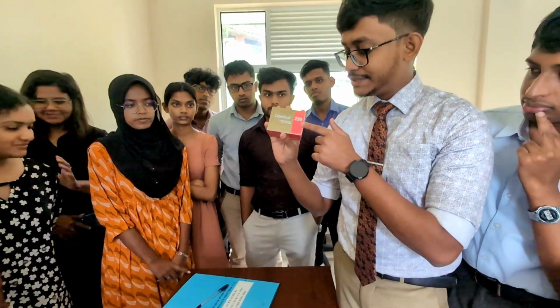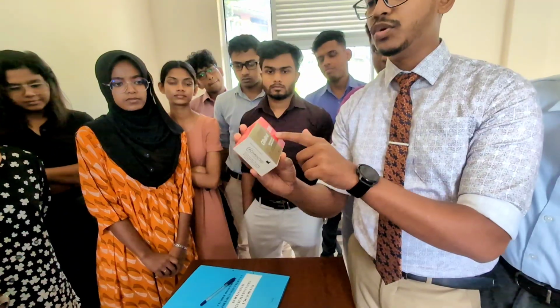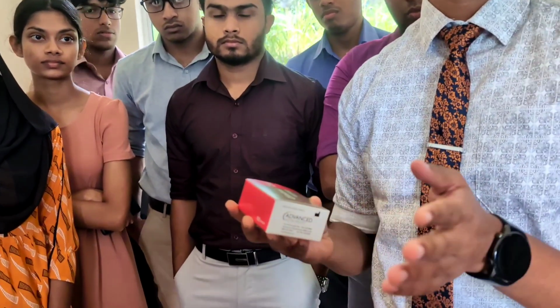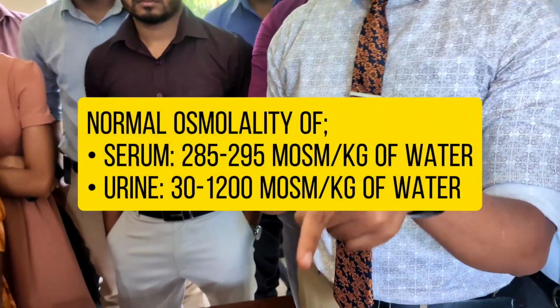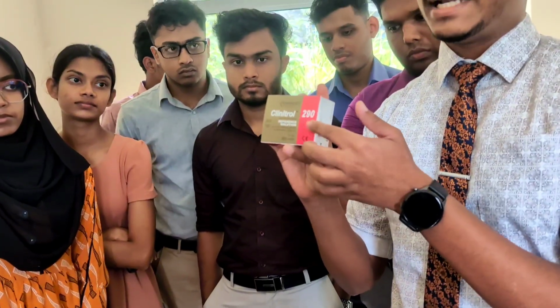This is calibrated so that the reading should resemble the normal serum osmolality. What is the normal serum osmolality? 285 to 295. Yes, so this is calibrated so it will represent that.